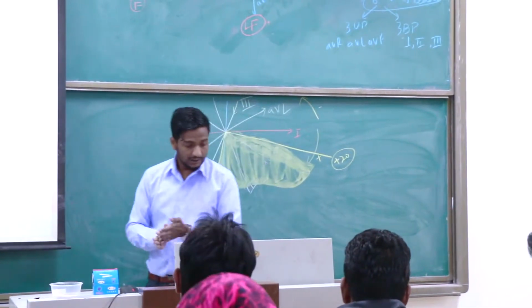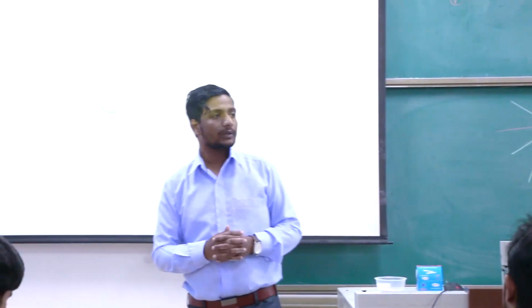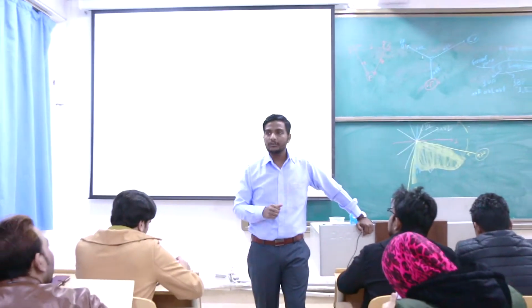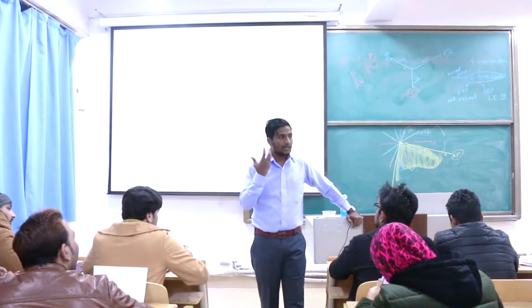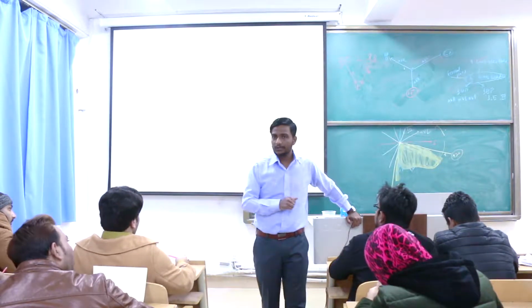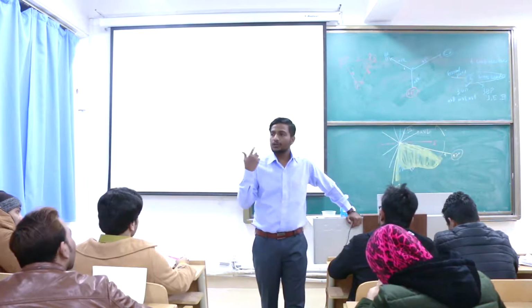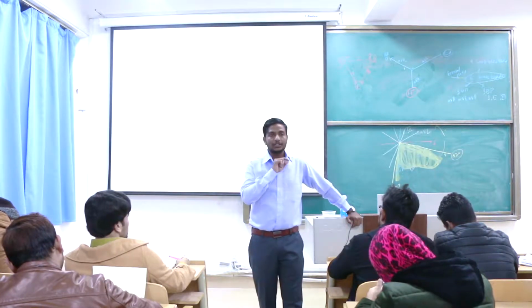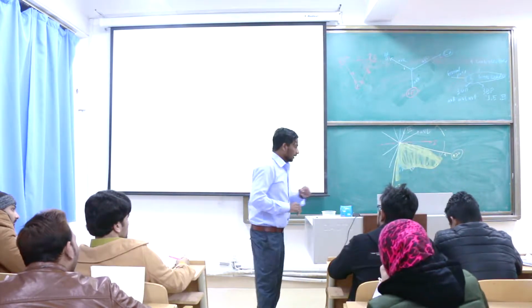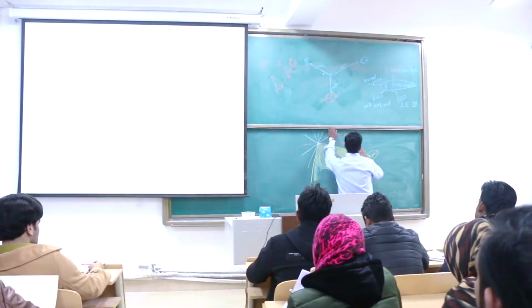Now let us go to the chest electrodes. Can you give me an example of chest electrodes? V1 to V6. And as soon as you find the letter V, what is the meaning? Will they behave alone or work in a group? Alone. And if they work alone, will they behave as positive or negative? Positive. And the negative will be the center of your heart or the center of your body. And what will be the axis of the current coming from the center of your body to the electrodes? Right? And these V1 to V6, let me just remove this one here so we can see more clearly.